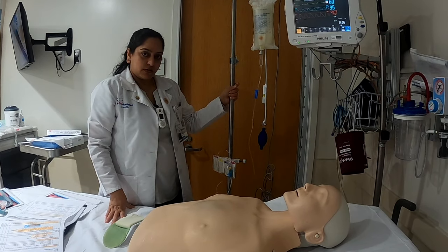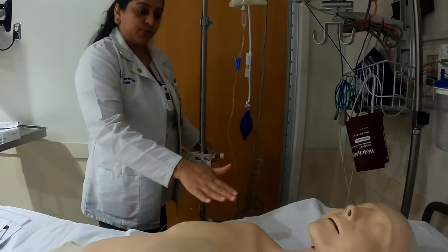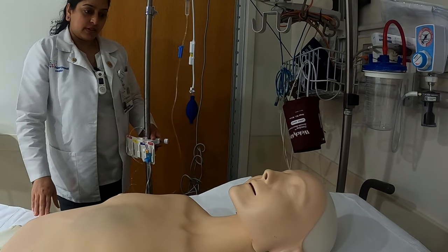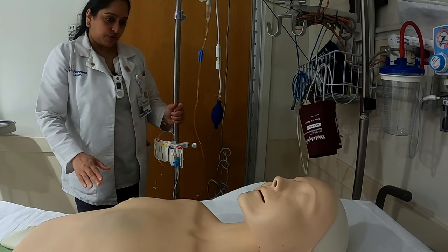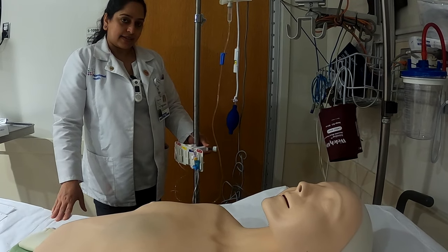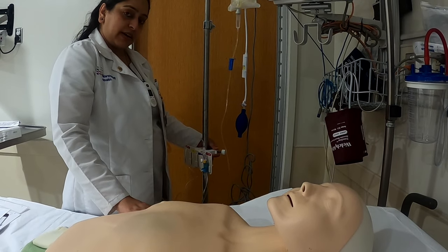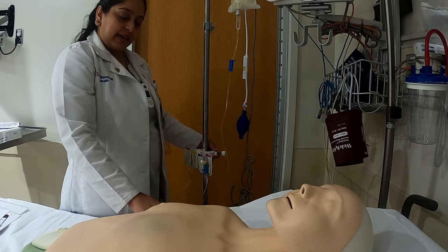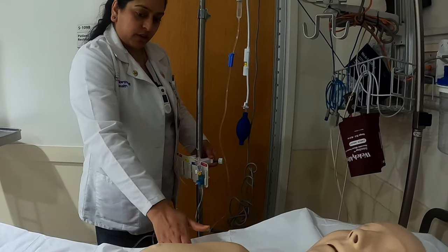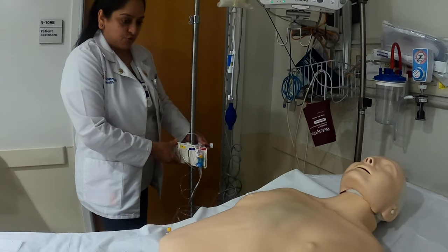This video is about how to zero an A-line. Before you zero the A-line, you want to make sure your patient is either lying flat, supine, or up to a 30-degree angle. You need to make sure your transducer is at the phlebostatic axis — your fourth intercostal space, or an imaginary line mid-axillary — and the intersection will be your phlebostatic axis. That's somewhere closer to your nipple line, right below your axilla, and that's where you would position your transducer.